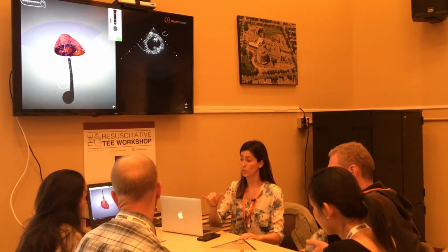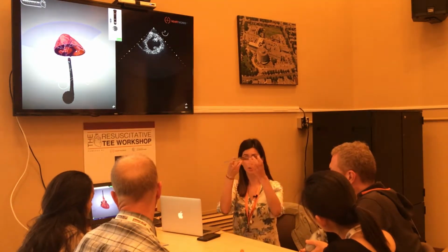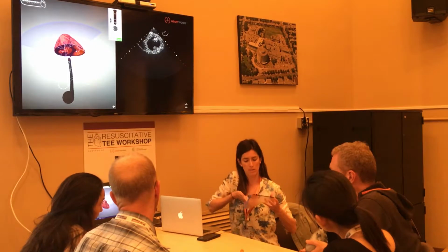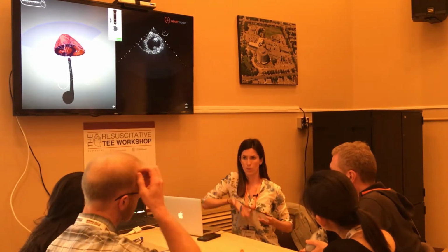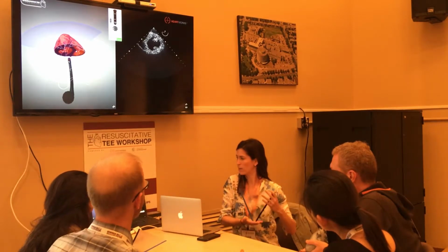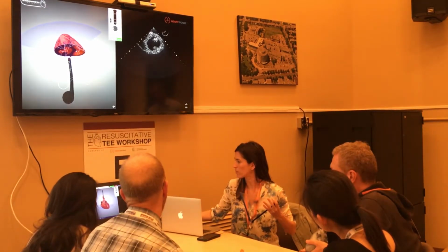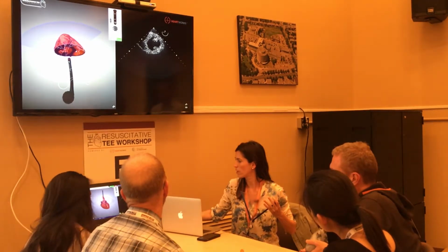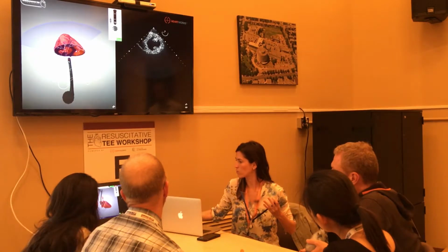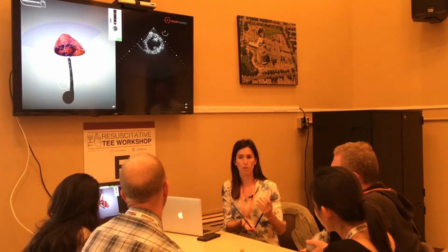Yeah. 0 degrees. So you're going to actually go even a little bit deeper than that, but the natural curve of the esophagus and that back wall of the stomach will push the probe within this curve, okay? If I move this over here, kind of come up, drop it a little bit deeper here, and I'll turn the heart over this way, you're seeing this natural curve of the probe, okay?